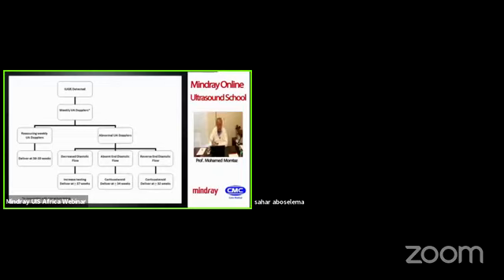If you find abnormal artery Doppler, you will see if it is either decreased diastolic flow, but there is still diastolic flow, or absent end diastolic flow, or reverse end diastolic flow. If you have a decreased diastolic flow, then you will increase the frequency of testing, usually every 2 or 3 days. As long as it is positive diastolic flow, but the ratio is decreased, you will wait until 37 weeks and deliver.